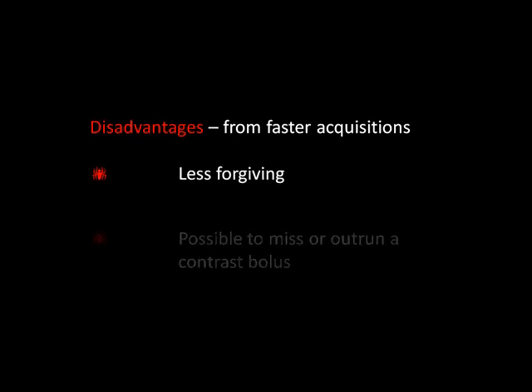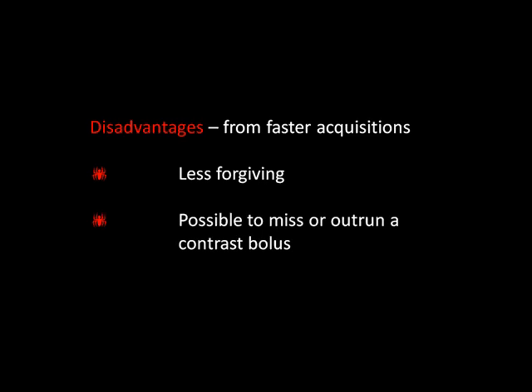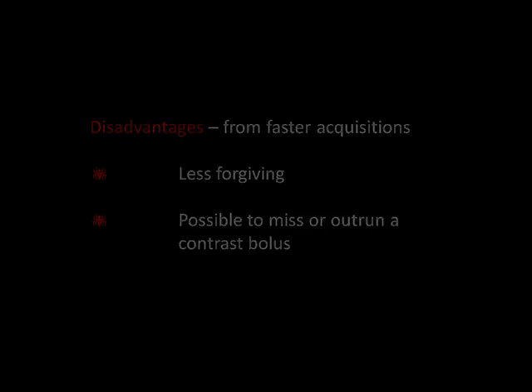The disadvantages from these faster acquisitions is that it's less forgiving, and it is possible to miss or outrun a contrast bolus.